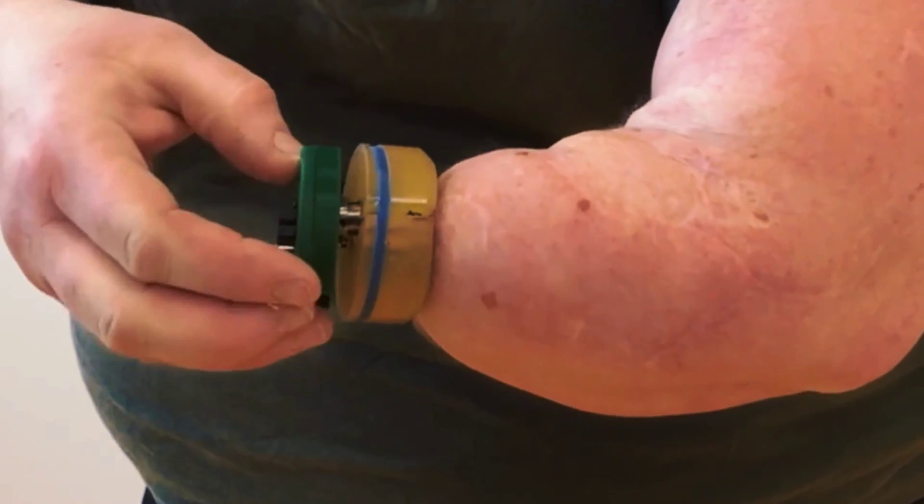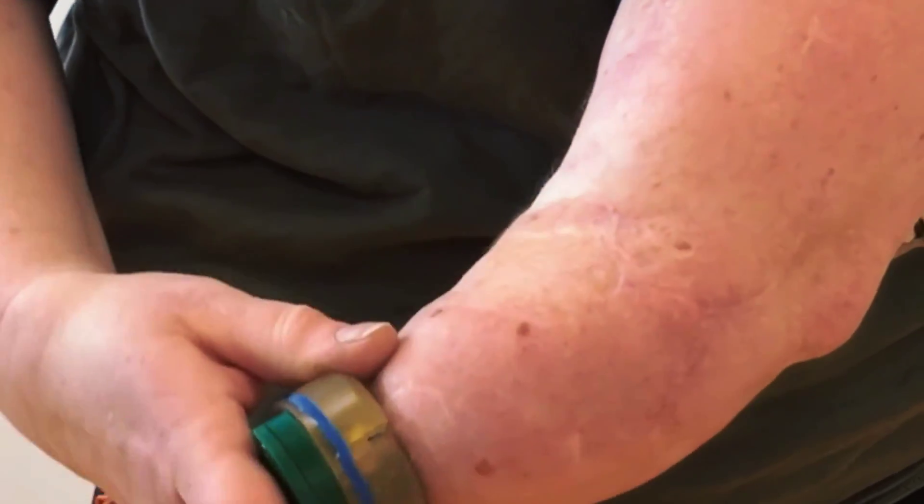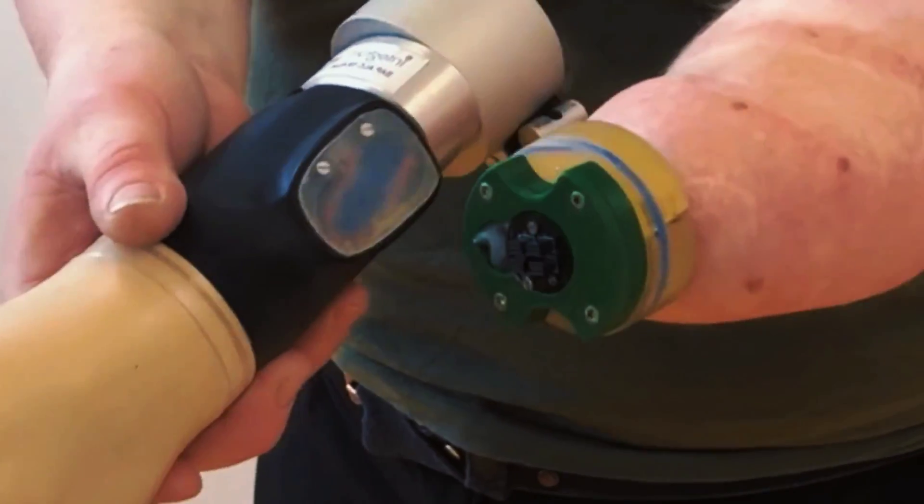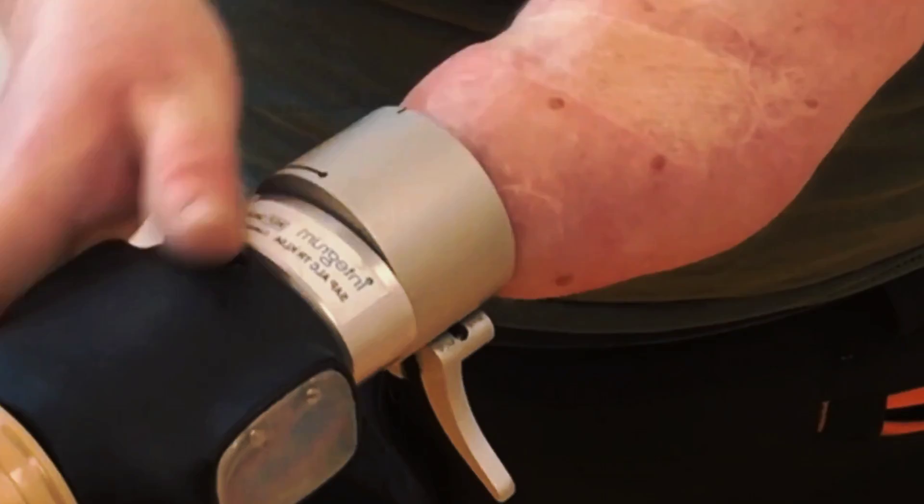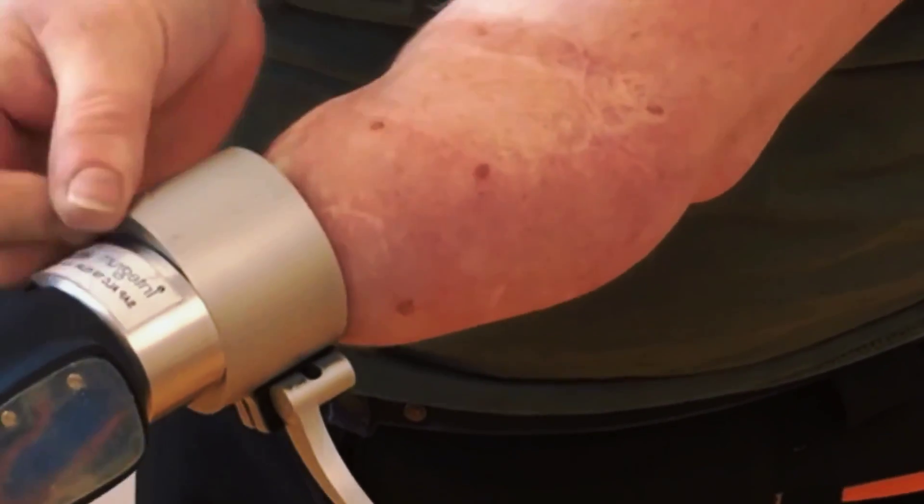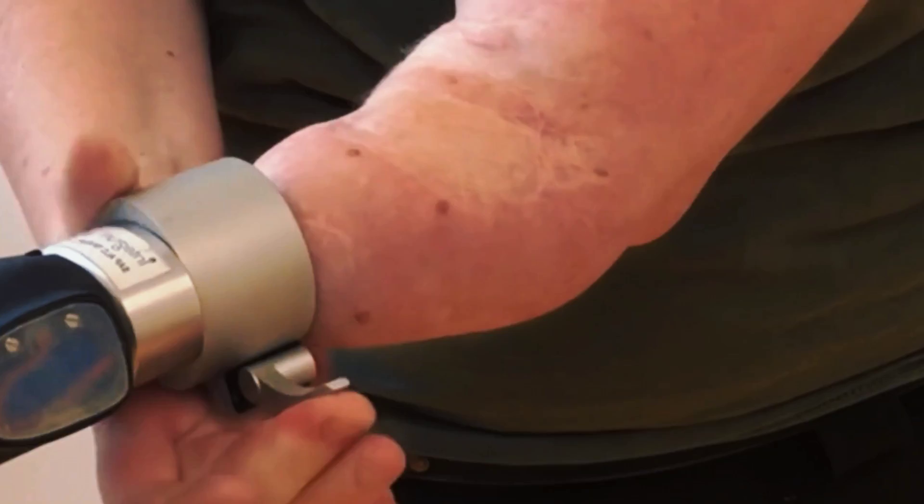A study published in Science Robotics revealed that Karen's case is a success story that demonstrates how advanced technology can restore human function in an unprecedented way. The researchers said that they are still far away from replicating all the functions of a biological hand, but they definitely made a considerable step forward.